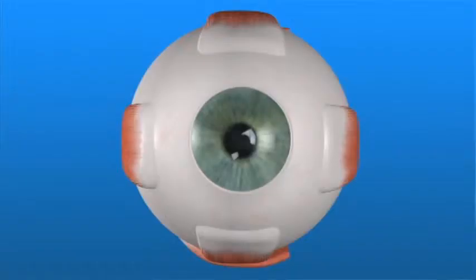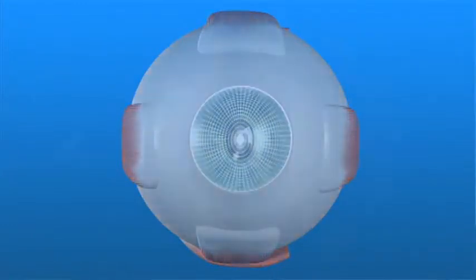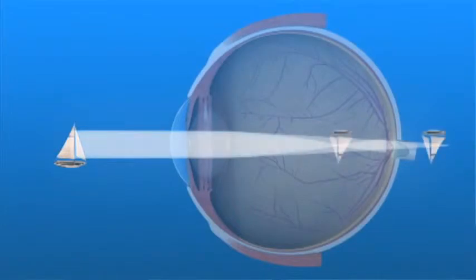If your cornea is not perfectly rounded, it produces a natural blur called astigmatism, requiring you to wear glasses or contact lenses to see clearly. Astigmatism is not corrected by cataract surgery alone. If you have astigmatism and a traditional monofocal lens is implanted during cataract surgery, you can have excellent vision with eyeglasses. However, if you want better vision after cataract surgery without having to wear glasses, your ophthalmologist may treat the astigmatism by making tiny incisions in your cornea, called limbal relaxing incisions.